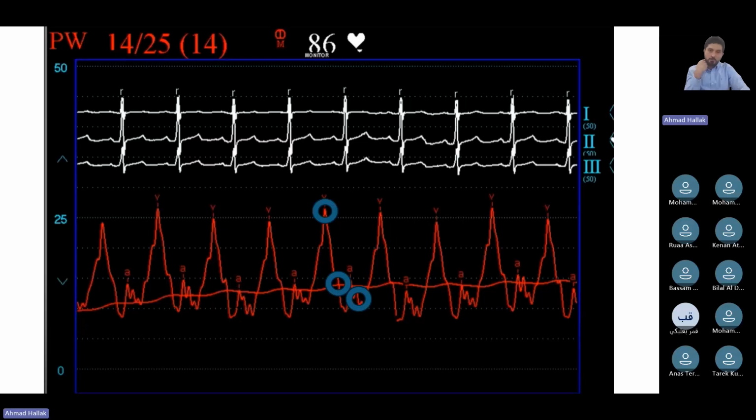If you're working on fixing a mitral valve regurgitation, this is the most important number for you, but these are also important. If you're talking about a patient with pulmonary hypertension, then the RV is pumping against the mean pressure, so you really want to report the PA wedge mean pressure. And if you're talking about heart failure, then the most important number is the end diastolic pressure, because this one correlates the best with the LV end diastolic pressure.